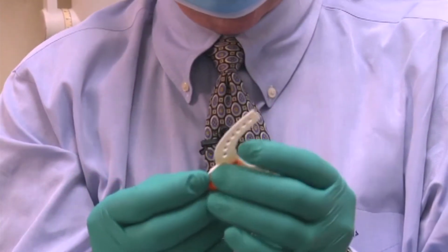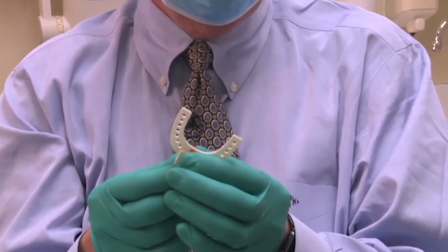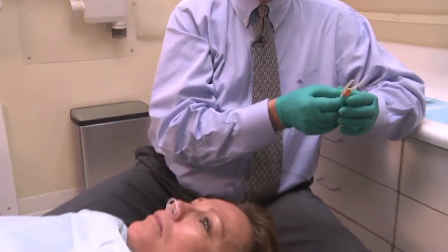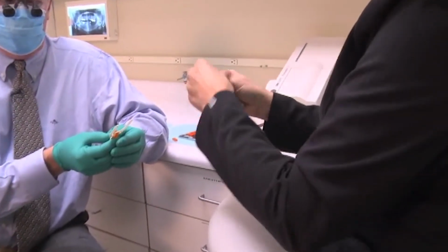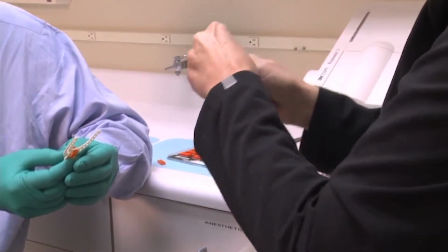So once again, we're going to use our polyvinyl putty. Go ahead and mix, Tammy. 3-minute set. And Tammy will load a little bit extra on that lower left side, because Kim is edentulous there.